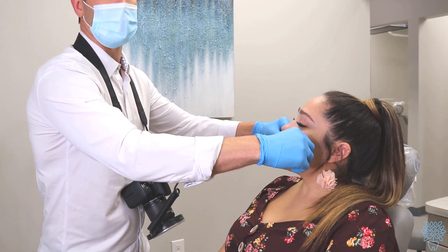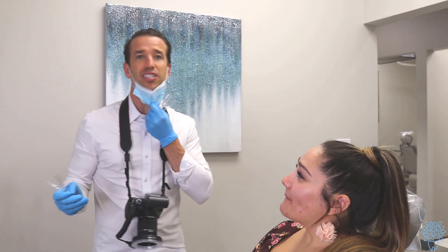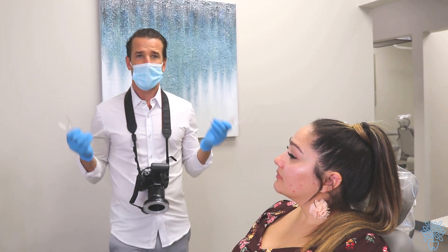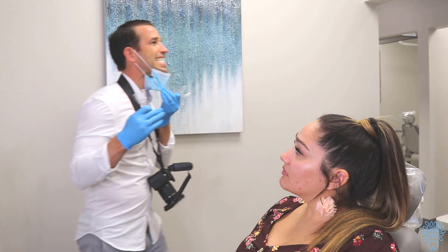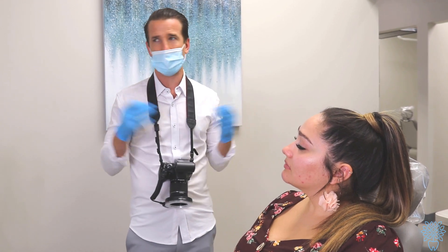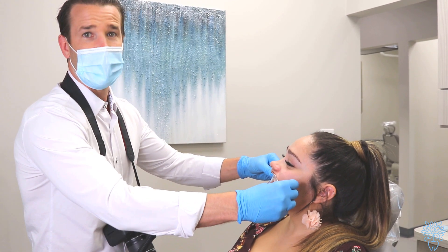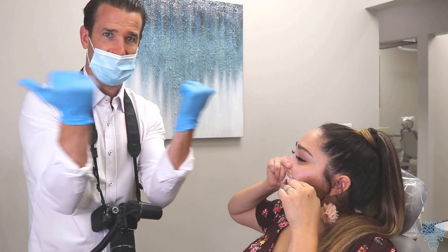Have them bite down — this is important. When patients bite down, they tend to want to touch their front teeth, which is wrong. You have to make sure they're biting down normally. About 95% of the time, if they're biting normally, their back teeth are going to touch. If they're biting incorrectly, the back teeth don't touch. We don't want pictures where their bite is off — that defeats the whole purpose.